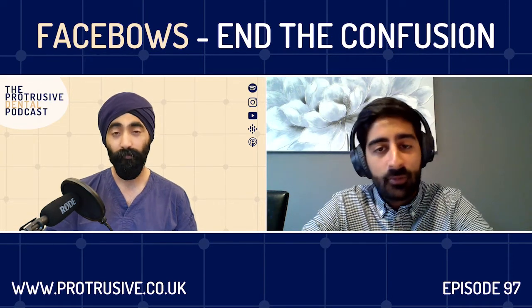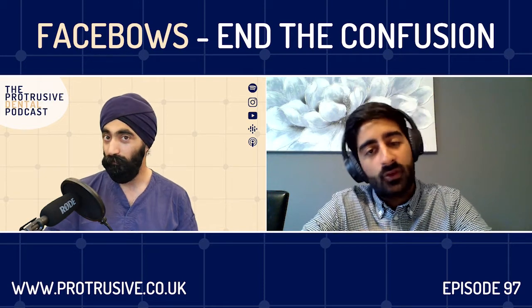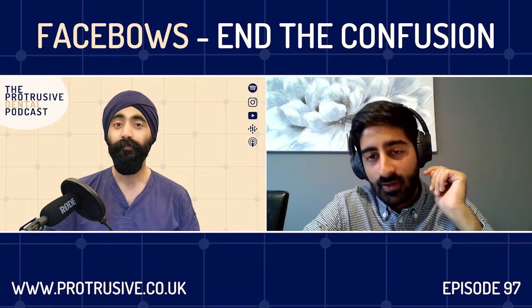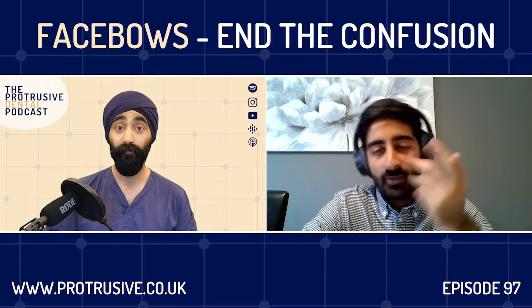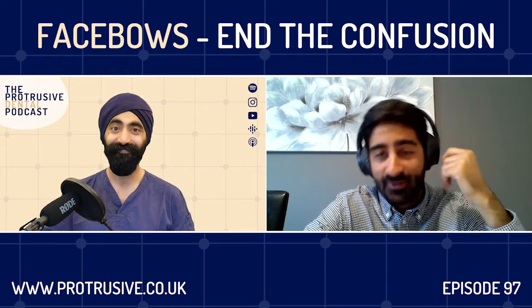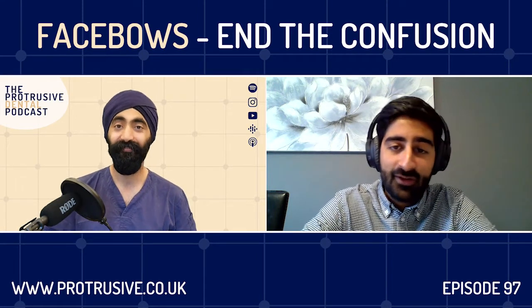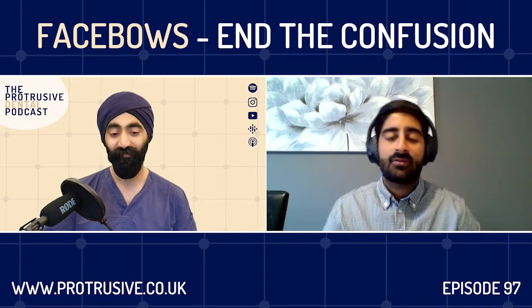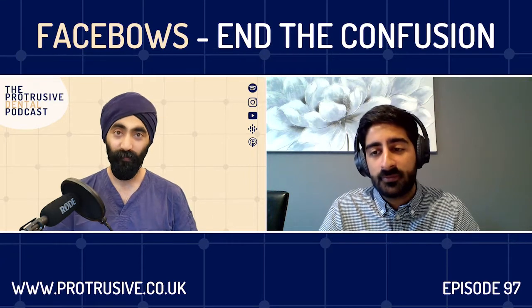And I mainly just go for the upper 3 to 3. I roll it over, and then once it's set, you draw some lines. You get your Sharpie marker, and I usually draw a horizontal line and a midline. But you can even add things like canine lines, full smile lines, resting smile lines, because you can change it and adapt it. And the best thing is if you get the line wrong, you rub it out, start again, and just send it off, and it doesn't get distorted in the post. Take a photo. It's so much simpler, and that's really helped me out a lot in practice.